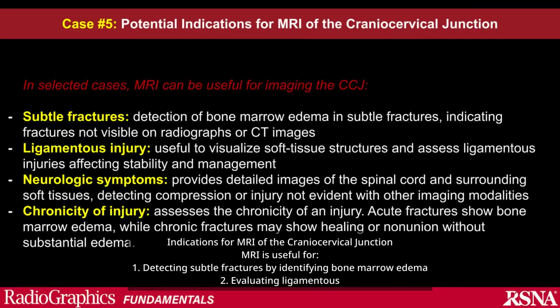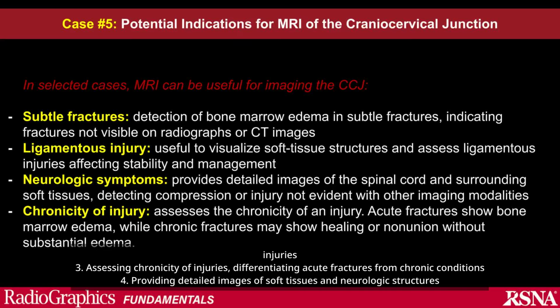Indications for MRI of the craniocervical junction. MRI is useful for: 1. Detecting subtle fractures by identifying bone marrow edema. 2. Evaluating ligamentous injuries. 3. Assessing chronicity of injuries, differentiating acute fractures from chronic conditions. 4. Providing detailed images of soft tissues and neurologic structures.